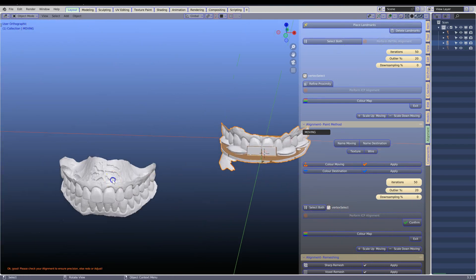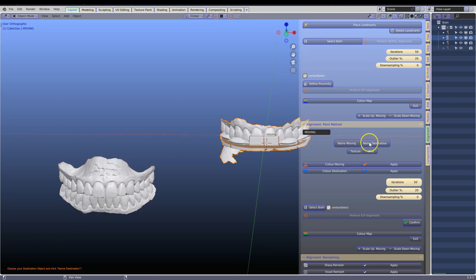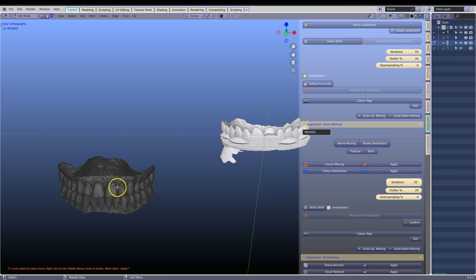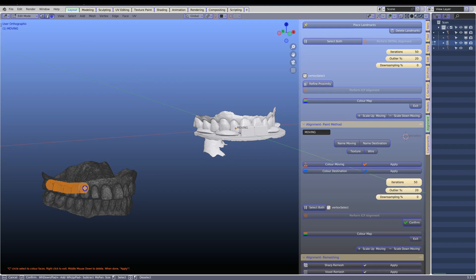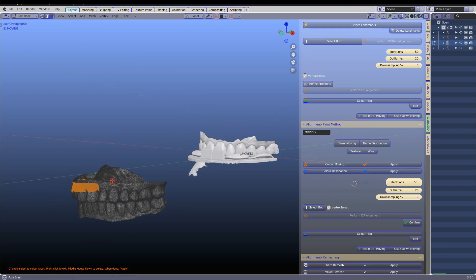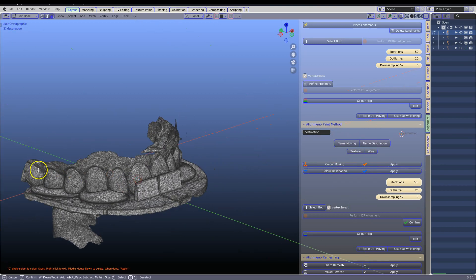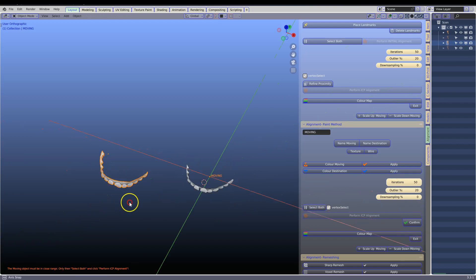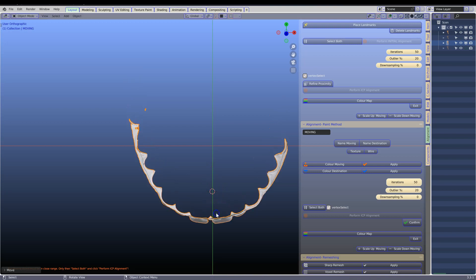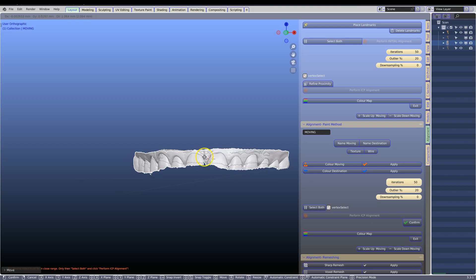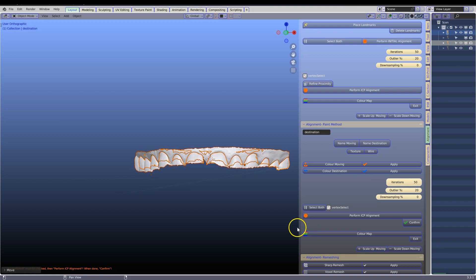Next we want to do the same thing using the models which are linked. This becomes my moving, and this scan becomes my destination. We're going to colour the moving — we want to get a similar pattern. Using the C key, stroke across like this. Apply, then colour your destination and apply that. Grab your moving target model and place it into the same vicinity. Select both of them and perform ICP. Then confirm.